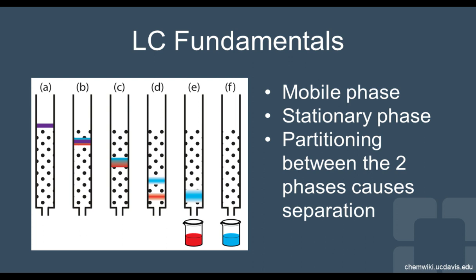So some of you may be familiar with chromatography from back in your undergraduate or graduate days. I remember we performed forensic type of experiments where we'd have different pens, and then the pen of the person who wrote the ransom note we're trying to decipher. In this experiment, we were putting a dab or writing on the piece of paper with the 3 different pens, and then placing them into a solvent system. The solvent would wick up the paper, and then you would see the black pens would then break down or fractionate into their constituents of the colors that made the black ink. And then you could be able to pinpoint what pen was used by the kidnapper, for example.